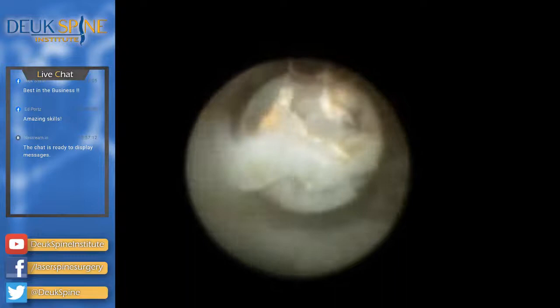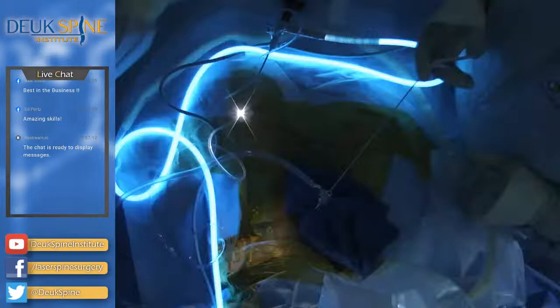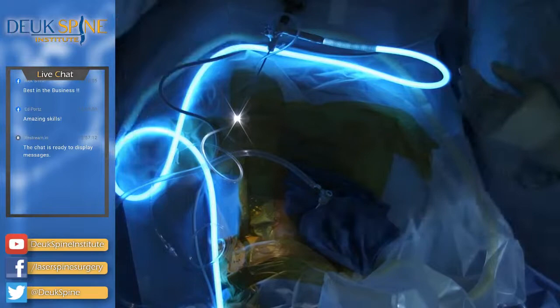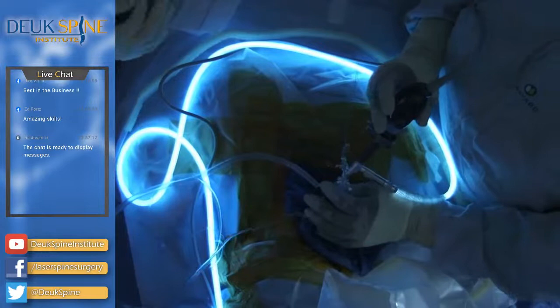But no, seriously, these are all pieces of collagen or scar tissue, basically, that shouldn't be here. They're out of place. Let me grab that out, too. You can see the golden color. It comes from the calcium within the scar tissue. And this is the end result of inflammation, scar tissue. All right? Now, inflammation is a normal part of healing, but it's limited, okay? It's limited inflammation. When the inflammatory system goes haywire and you get too much inflammation for too long of a time, then you start getting problems like scar tissue and calcium and bone spurs. And that's what we're dealing with here, okay?